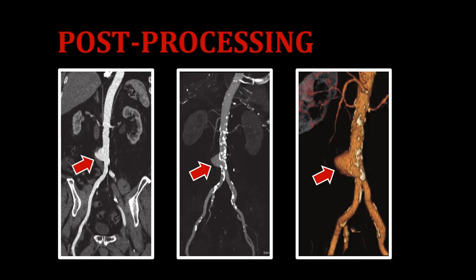Significant calcifications in the aorta and common iliac arteries are also very visible on the MIP, and we can still see that sac-like aneurysm at the level of the aortic bifurcation. In the last image to the far right, we're looking at the same patient with a similar view, but this time it's a 3D reconstruction — specifically, a volume-rendered 3D image. The red arrow is still pointing at the same area of concern: a sac-like aneurysm at the level of the aortic bifurcation.